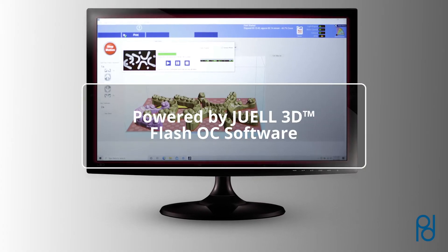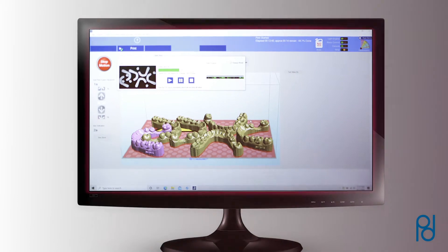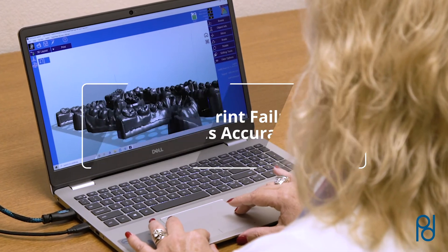JUELL 3D-3 is powered by JUELL 3D Flash OC software, a state-of-the-art software that optimizes accuracy and speed. The software runs a unique calibration process that reduces print failures and ensures accuracy.